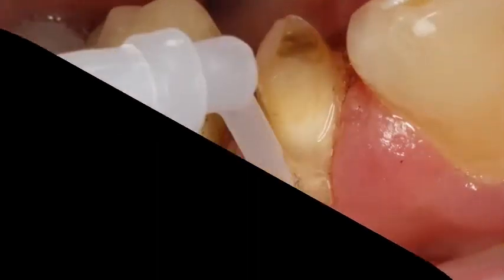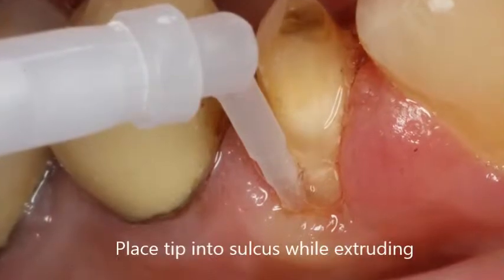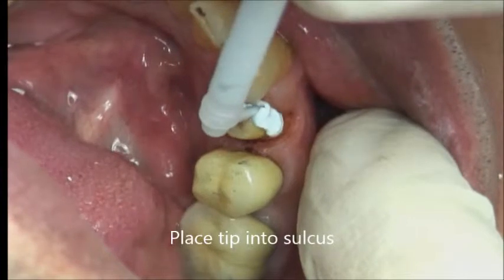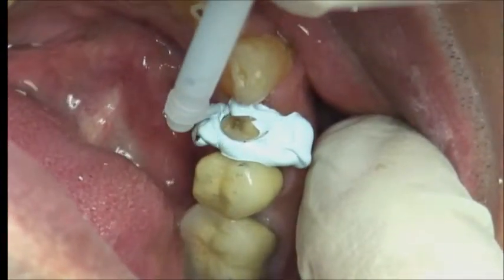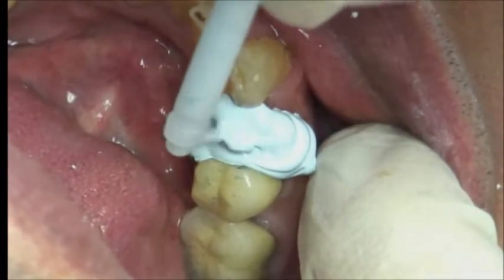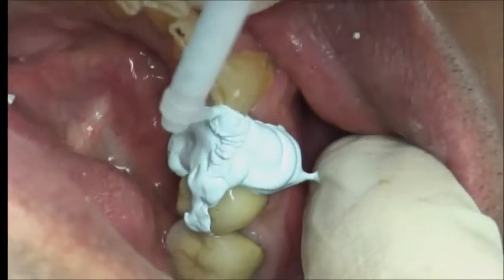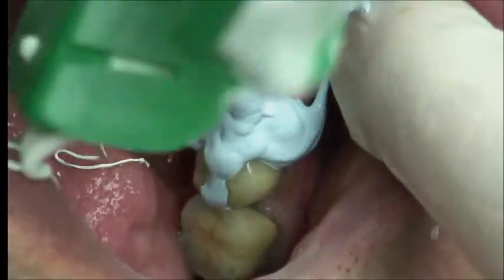The most important part of the technique with this impression material system is to make sure the tip remains in the sulcus while taking the impression. While taking this impression, I encircle the tooth one time with the tip completely embedded in the sulcus, and then a second time to make sure that the wash material completely covers the preparation. Finally, the tray is loaded into the mouth.